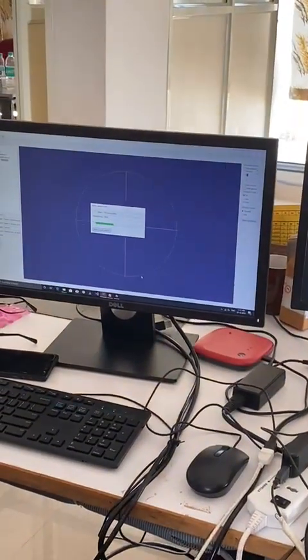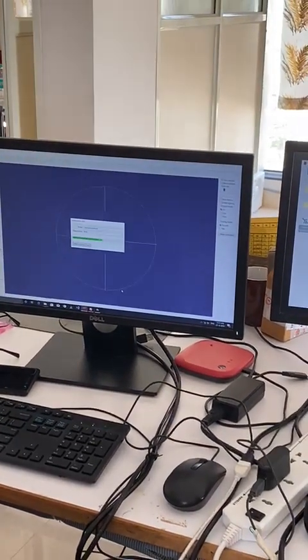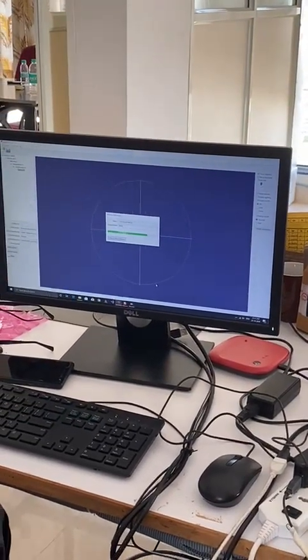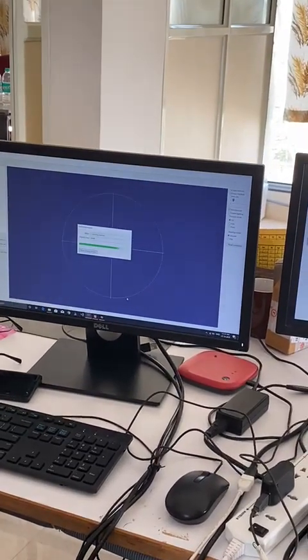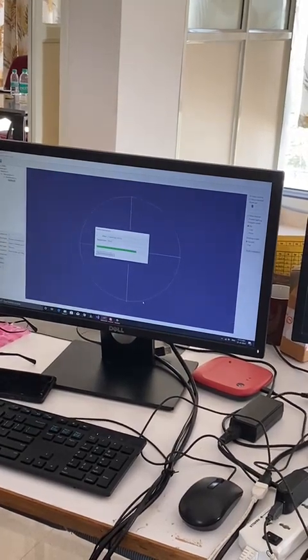Foolproofing system is that the second time it is taking a reference. Yes. Then it is making sure that we are on the right path. Yes. So that foolproofing system is there, then it will have two sets of data. Correct. If one failed, it will give you an error. Yes. Then you can scan it once more and match it.